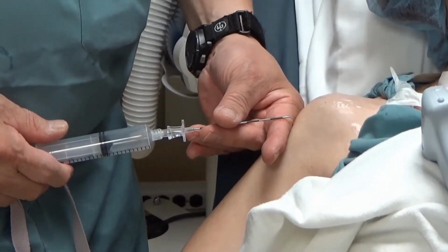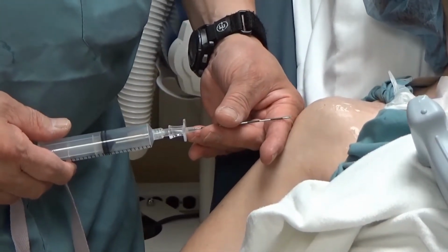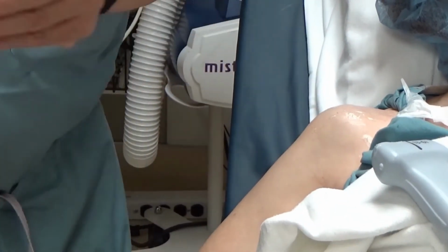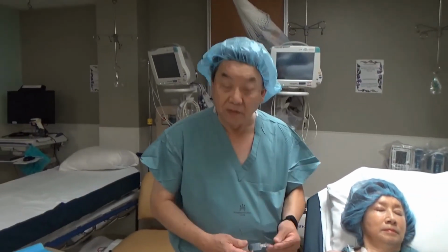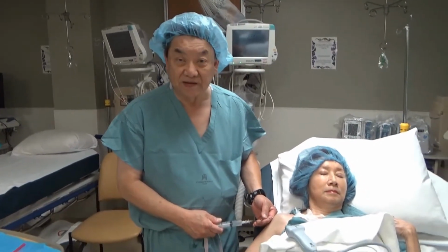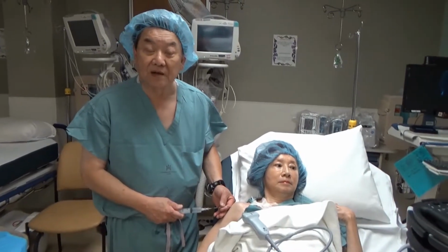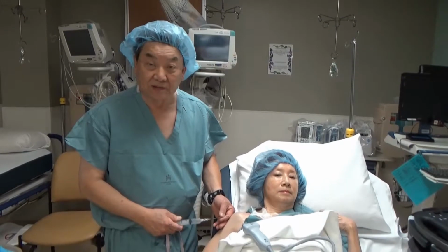However, I should mention that oftentimes the calcium deposits are quite large, and they're actually larger than the bevel of our Tuohy needle. So it's not possible to remove all the calcium. If the calcium itself is more of a toothpaste consistency, which is oftentimes the case, then we're better able to aspirate and to lavage the calcium.